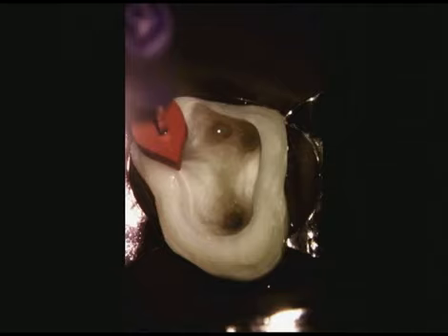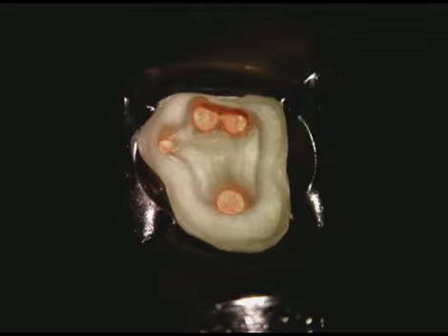And now we can visualize the pulpal floor liberated of restorative materials and the post free above the orifices. This paves the way for the Pro Ultra Endo 1 using the 10-minute rule. Following post removal, cement is removed from the mesiolingual aspect of the pulpal floor, and a displaced extra orifice is identified and the canal negotiated. We can observe the pulpal floor following 3-dimensional cleaning, shaping, and obturation procedures. A post-operative radiograph confirms the disassembly efforts, the smooth flowing shapes, and the packed systems.